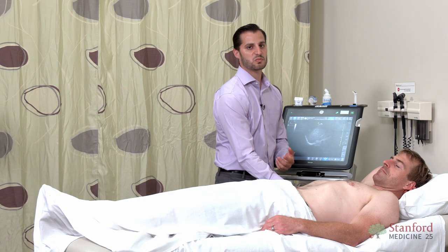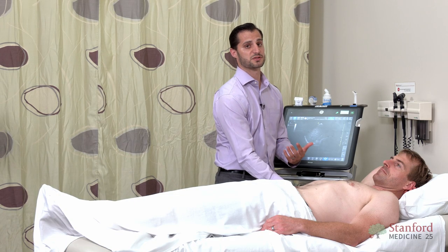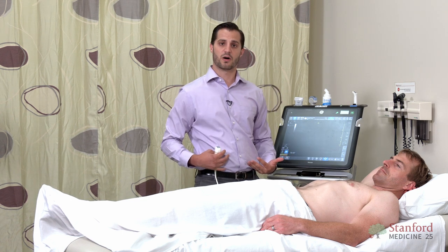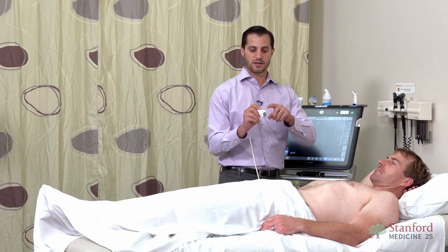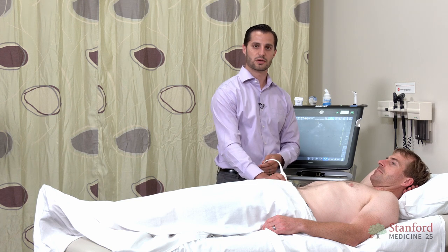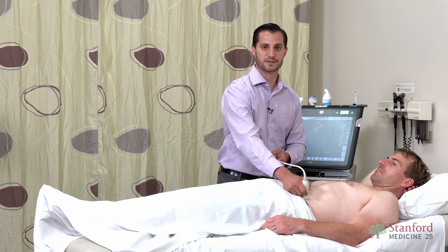If you have a patient who you suspect may have more moderate or more severe ascites, another area that you can scan is in the lower quadrants — the right lower quadrant and the left lower quadrant. Generally the marker is pointed in a three o'clock position, and you can scan the right lower quadrant and the left lower quadrant.